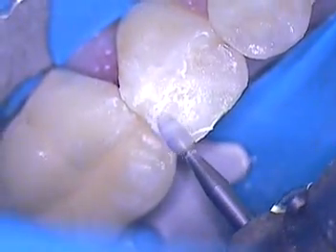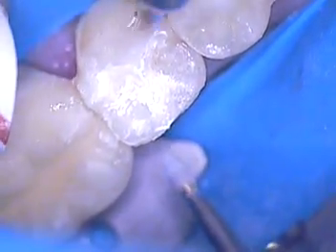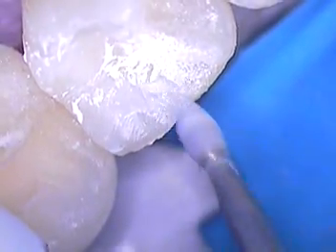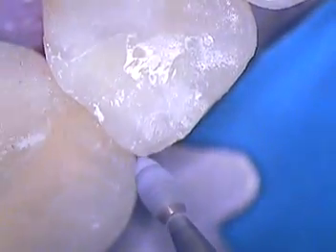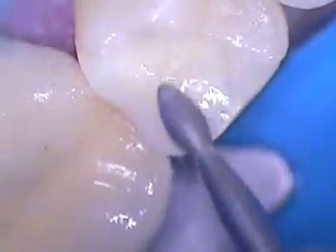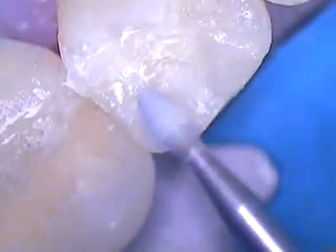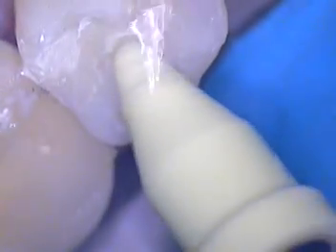Let me just take this down a little bit more — I'm also anticipating her bite. And the CAVO surface margin, if you look real close, there's our enamel composite margin. I'm going to just run this. I like a very, very light touch on the handpiece for polishing.